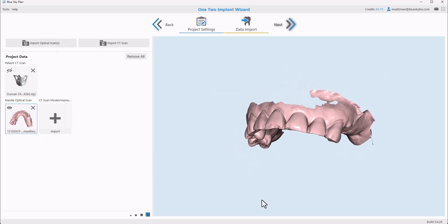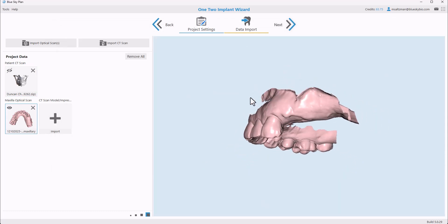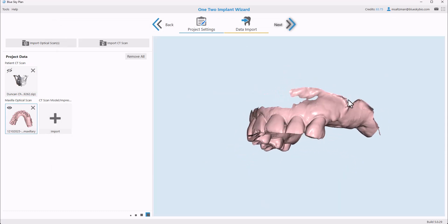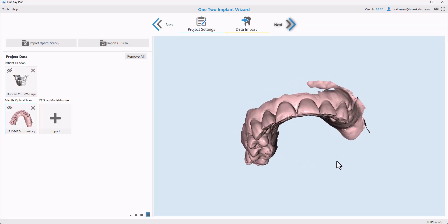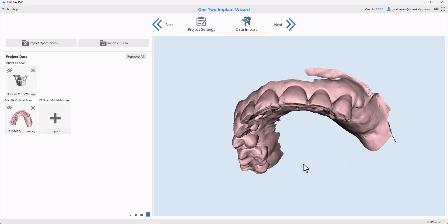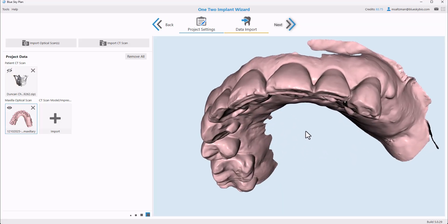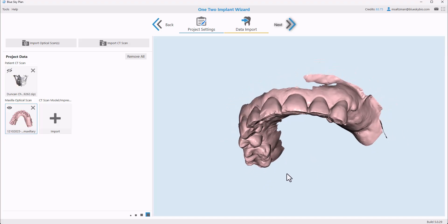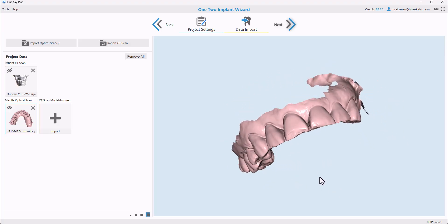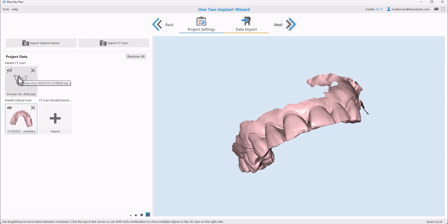We could see a preview of the optical scan on the right side of the screen. You could use your left mouse button to grab and rotate, and your right mouse button while moving your mouse forwards and backwards in order to zoom in and zoom out. Once you've selected the relevant files, go ahead and click the Next button.